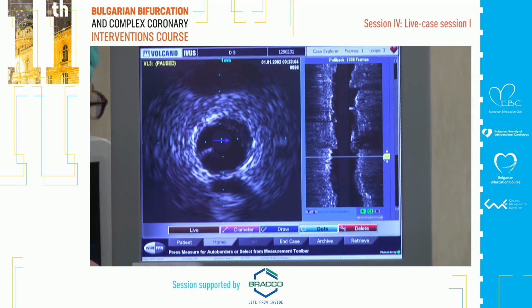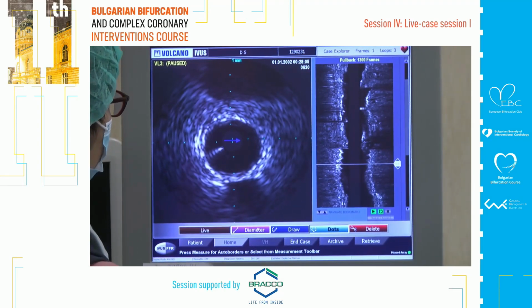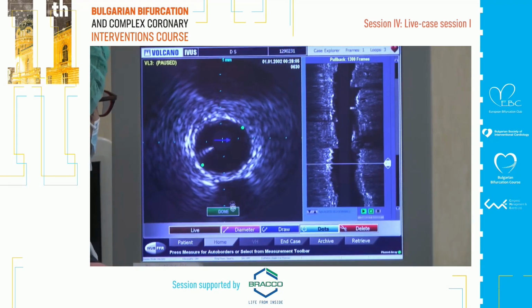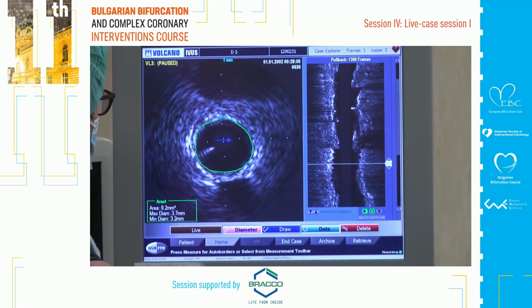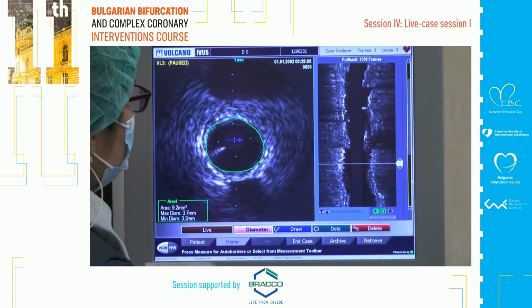So I think maybe we can stop here. We discuss, right? If we stop here, this one is media to media going to be. Oh, sorry, this is a mistake. Media to media here is going. Don't worry, let's do it later.